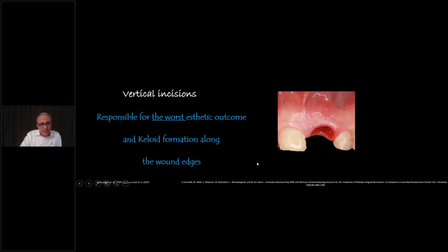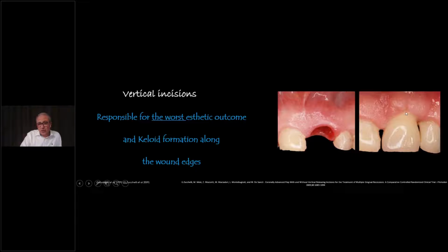And the vertical incision has been stated in the literature to be responsible for the worst esthetic outcome and keloid formation along the wound edges. So you don't get surprised when you see keloid tissues, when you see scar tissue formation along with vertical incisions. I'm not sure that this also is a valid solution.